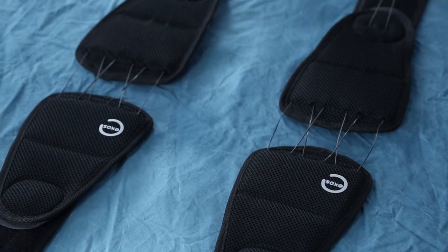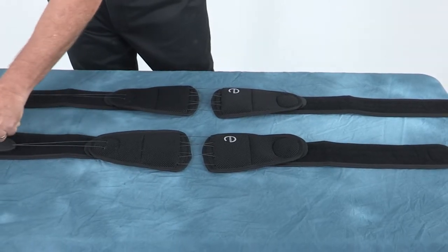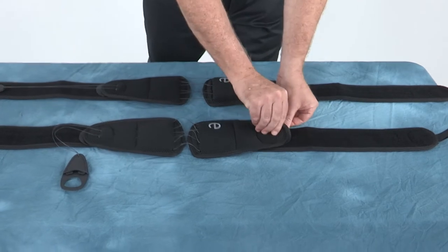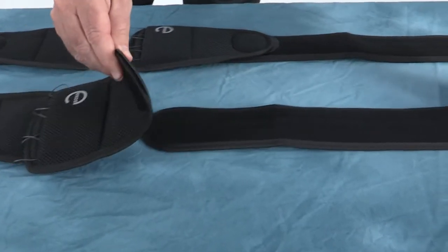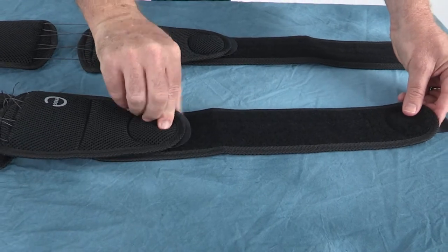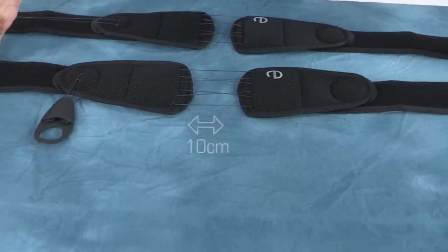To begin making adjustments to the belt, detach the pull tab from the belt wings. Detach the hook and loop connection to the belt wings to change the belt's circumference. Verify that the gap between the posterior section of the brace is approximately 4 inches or 10 centimeters.